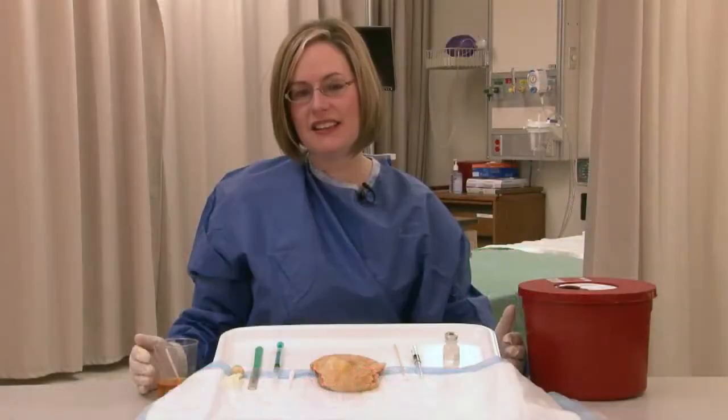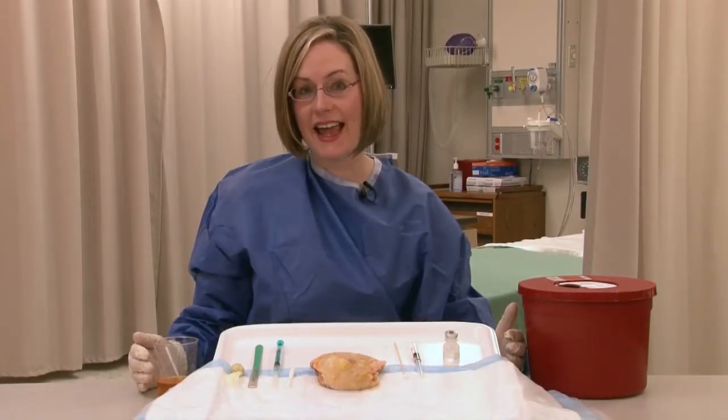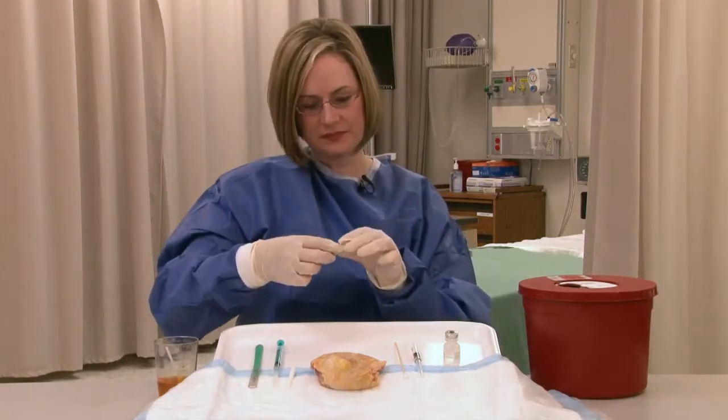This is a simulation of an incision and drainage of a Bartholin gland abscess with Word catheter placement. I'd like to show you how I created this simulation.